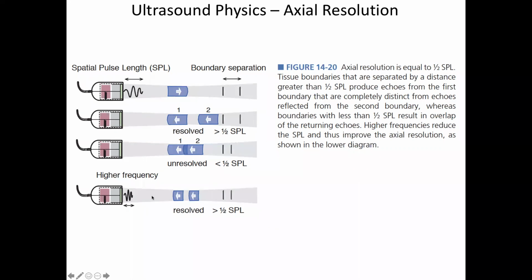When we listen to these packets of the fundamental frequency coming back, we really want to detect that pulse, and essentially you demodulate it so that it just looks like a DC blip. That occurs in electronics back here, because we know precisely what our transmit pulse was, so we can demodulate when the echo comes back.